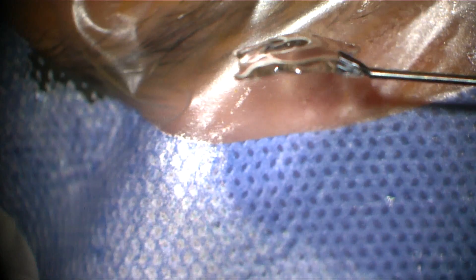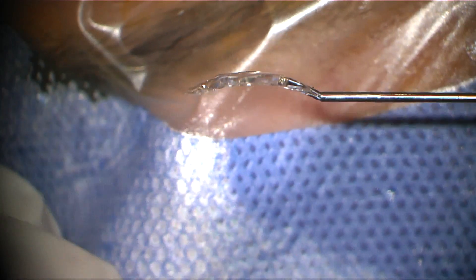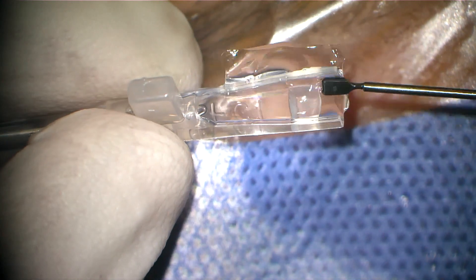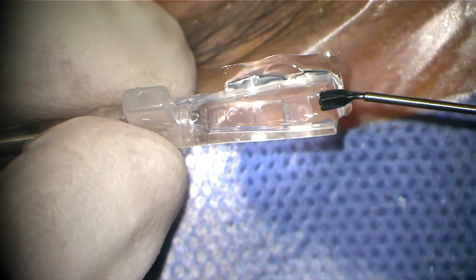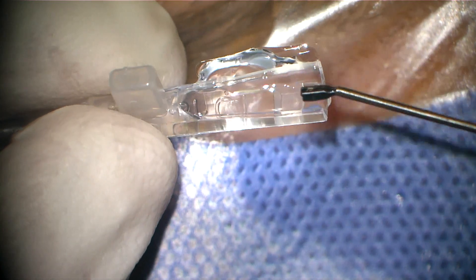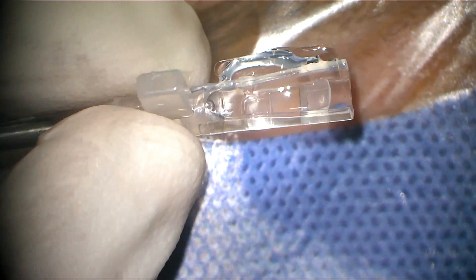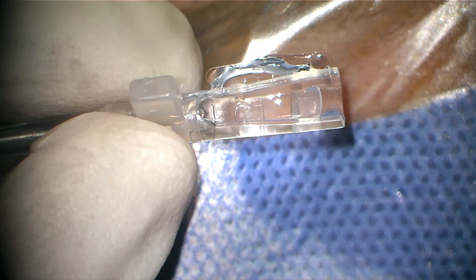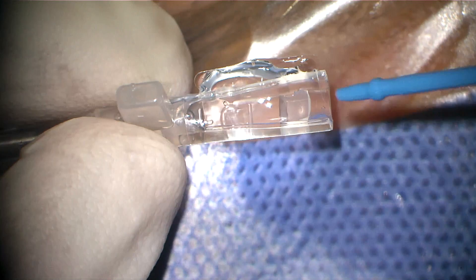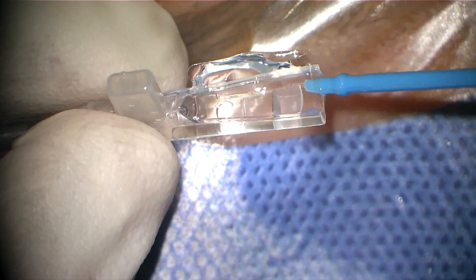As you can see, this is the concavity of the lens — it is concave from the inside and convex from the outside. It's important to place it in the correct position. We should handle the lens with extreme gentleness. I prefer to use the plastic end of the instrument rather than the Q-tip end for better control on the lens.